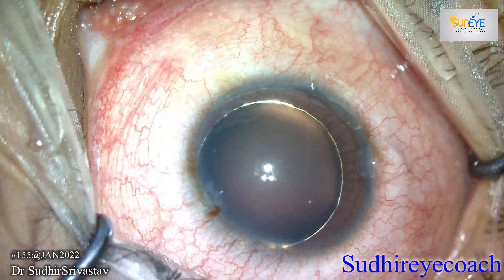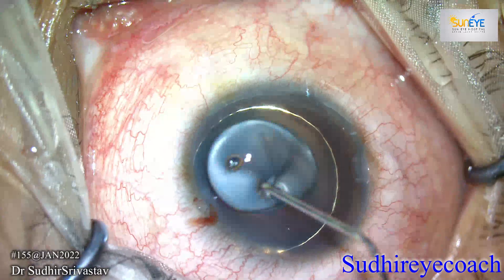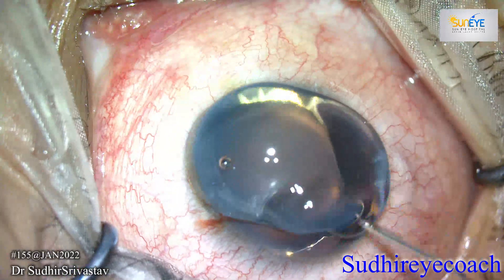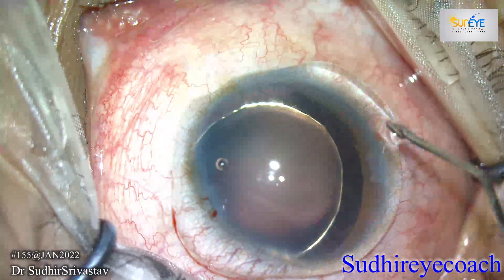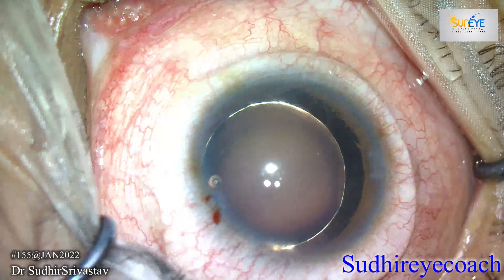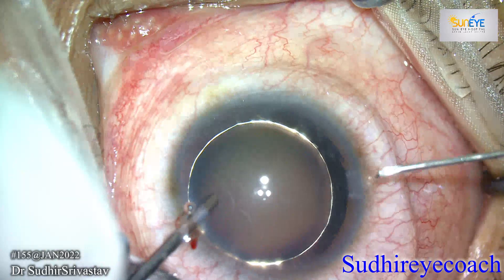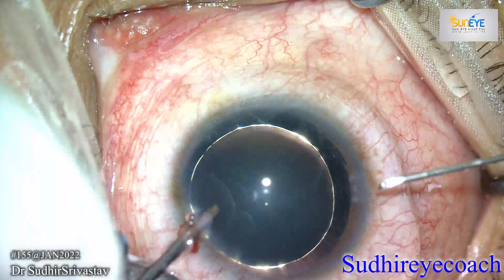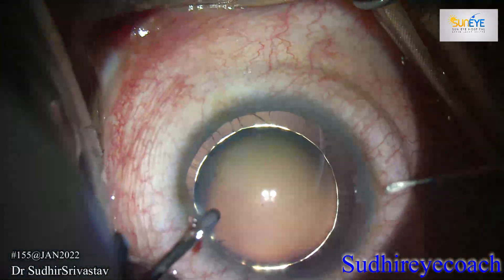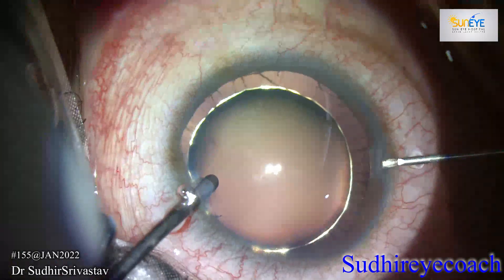First, I created two side port incisions and filled the anterior chamber with high viscosity viscoelastics. Because of the zonular laxity, performing capsulorrhexis is always a difficult task.